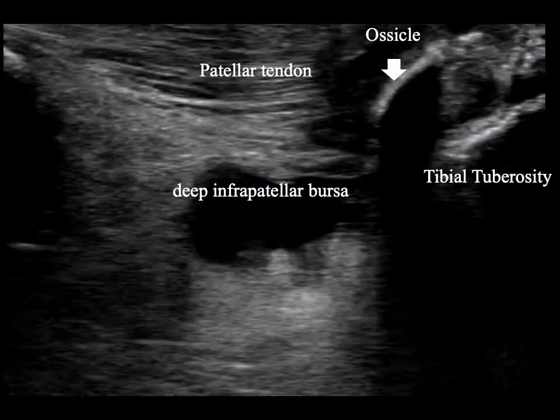This is the ultrasound image, and we confirm the location of the ossicle using ultrasound B-mode imaging. The white arrow indicates the ossicle.